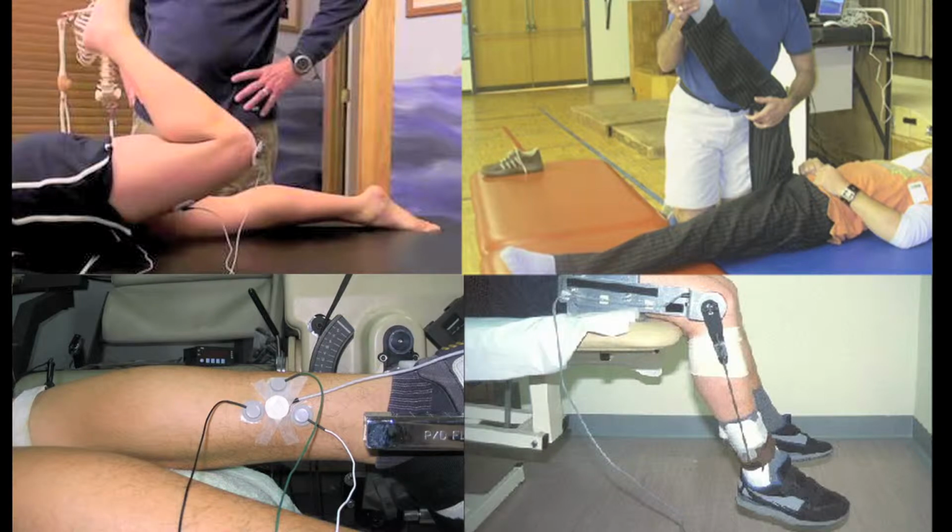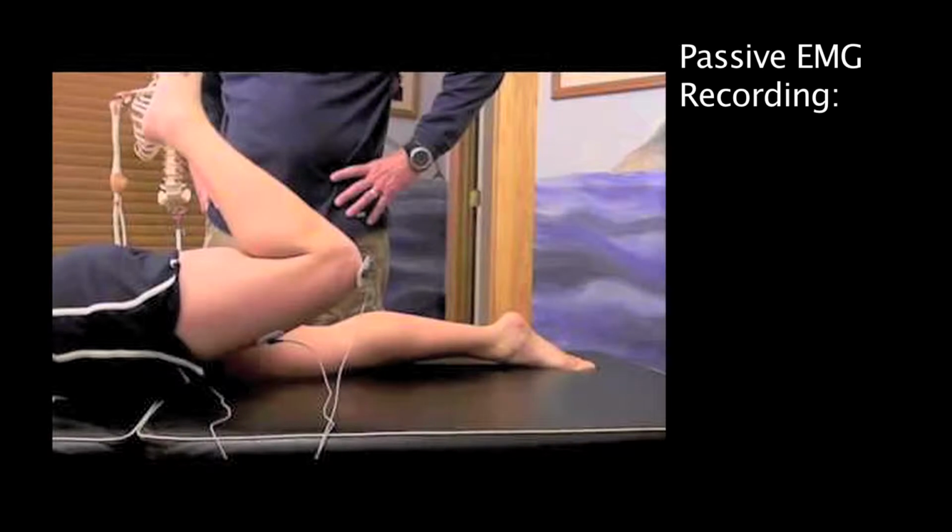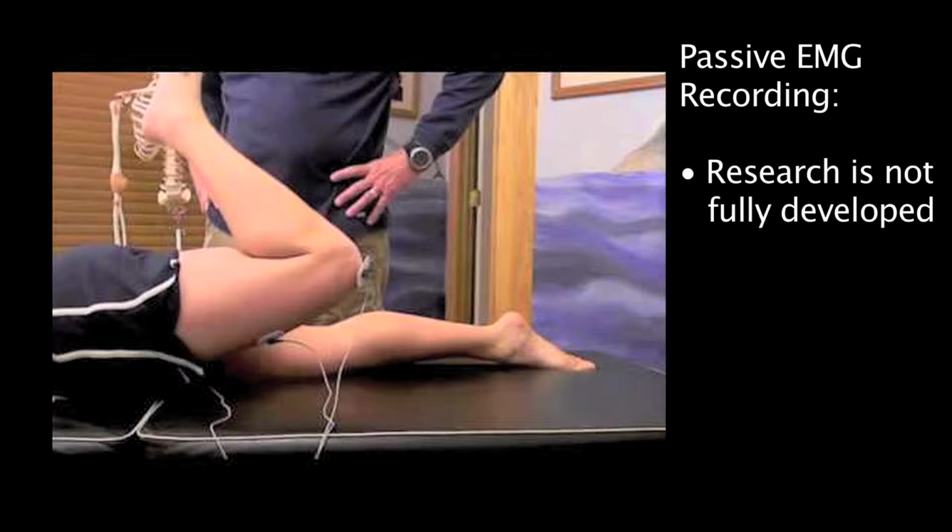Currently, the most common methods to measure spasticity are passive EMG recording, the H-reflex test, the Ashworth scale, and the pendulum test. Passive EMG recording involves placing electrodes on the leg and recording the signals using a computer. The problem with this is that it is not fully developed yet, and accuracy still remains an issue.